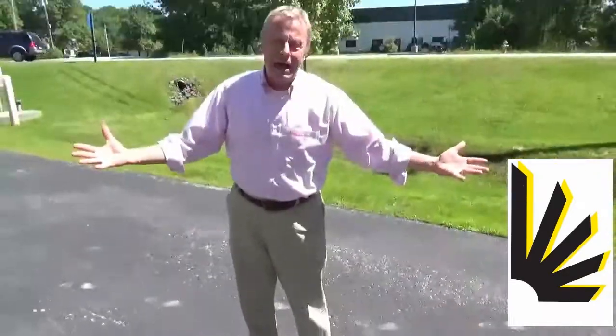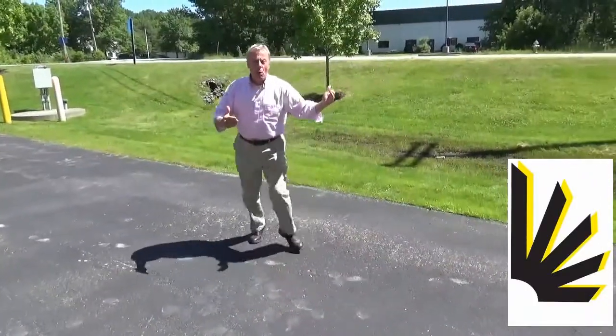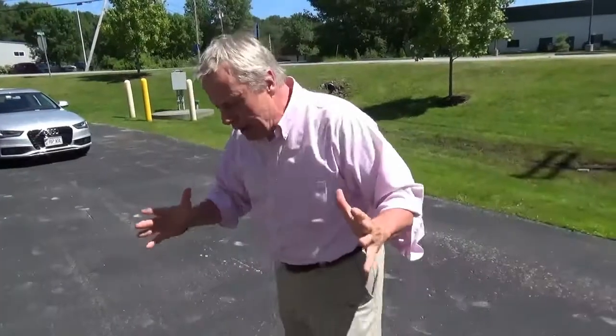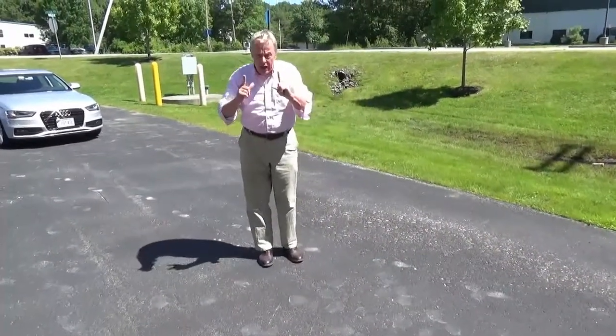I don't do that all the time, but it means that if I want to go out — if I want to go out dancing with my wife — I can do it. I couldn't even walk before. I'm going to show you what it looked like when I was without this device, and this is not an exaggeration.